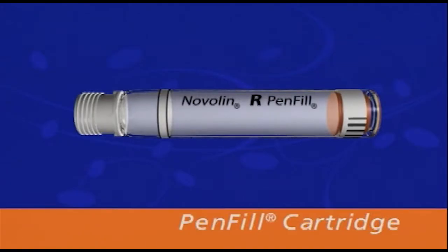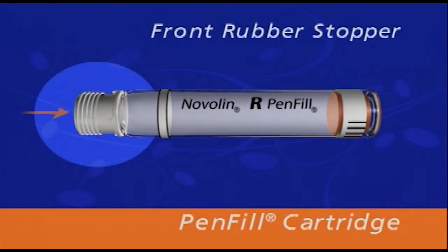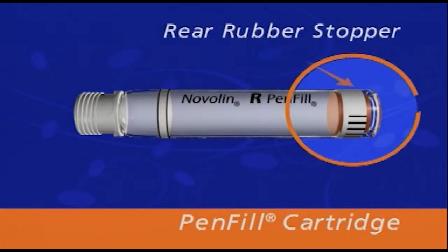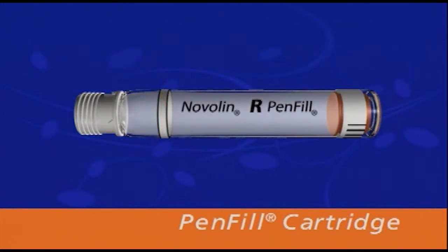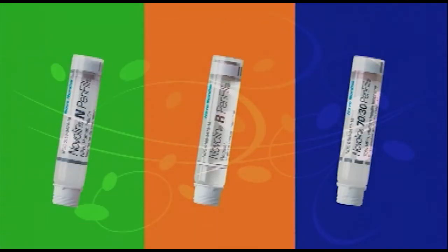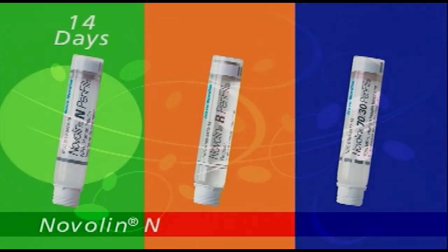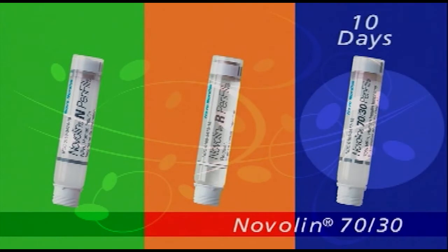Next, I want to tell you about another part of your NovoPen Jr. diabetes management system: the pen-fill 3-milliliter cartridge. The pen-fill cartridge contains 300 units of your prescribed insulin formulation. It also has a front rubber stopper and a rear rubber stopper, as well as a threaded plastic cap. Remember, you should store all unused pen-fill cartridges in the refrigerator, but cartridges that are in use should be stored in the pen at room temperature. Novolin N cartridges in use can remain unrefrigerated for 14 days, Novolin R cartridges for 28 days, and Novolin 70-30 cartridges for 10 days.